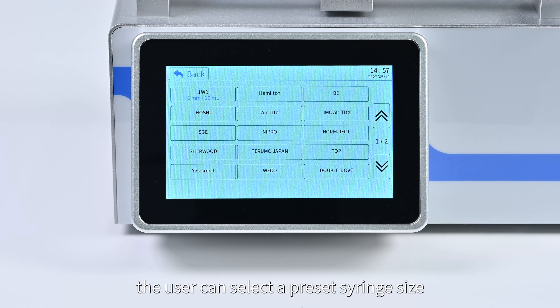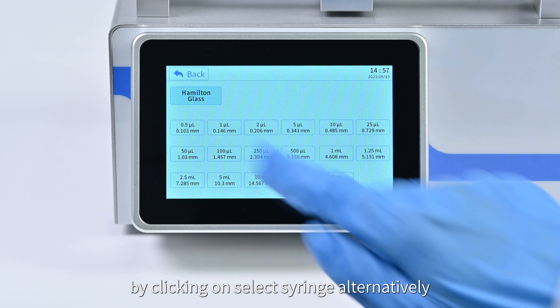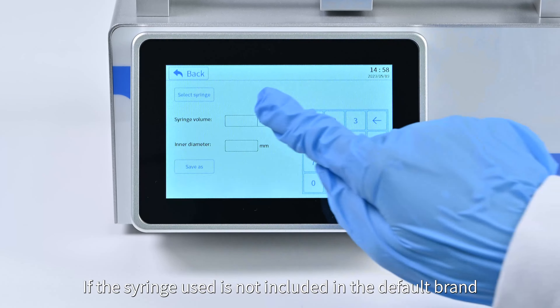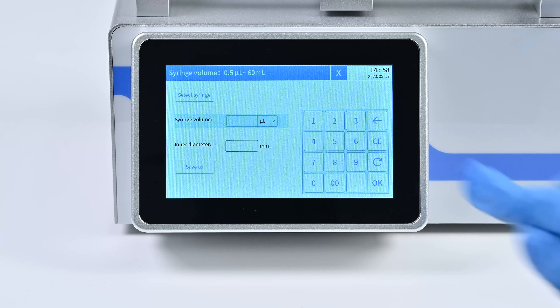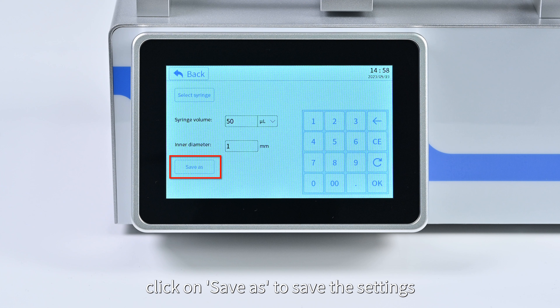In the syringe specifications interface, the user can select a preset syringe size by clicking 'Select Syringe'. Alternatively, if the syringe used is not included in the default options, you can manually set the size and inner diameter of the syringe according to your personal needs.